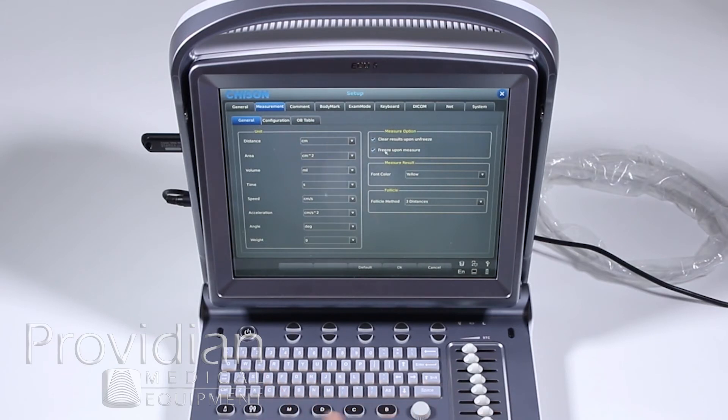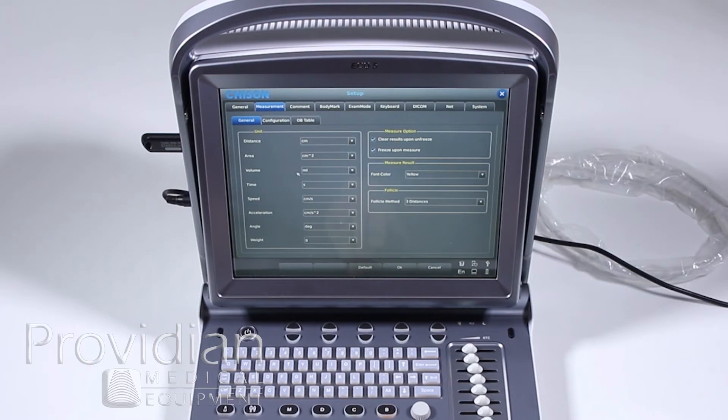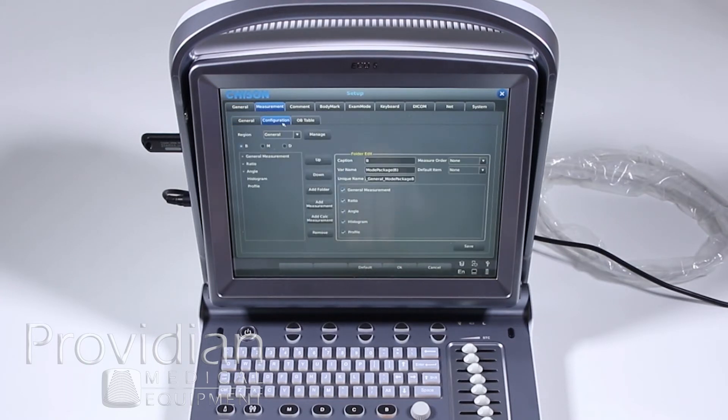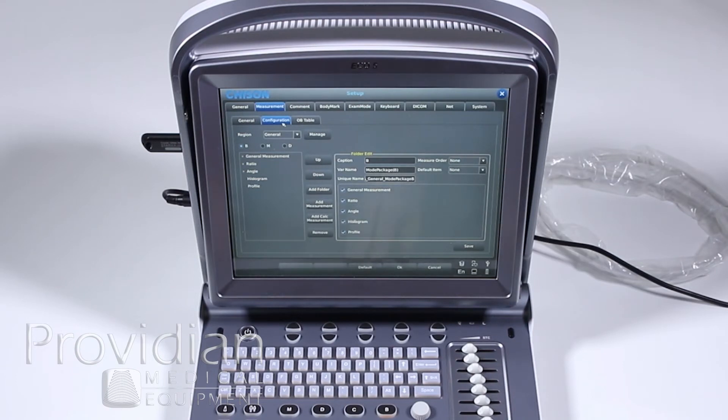If I hit the measure, will it automatically freeze? Font color. How many distances do you want to measure the follicles? Configuration. This gets into fairly deep stuff on setting up your own configuration for measurements.